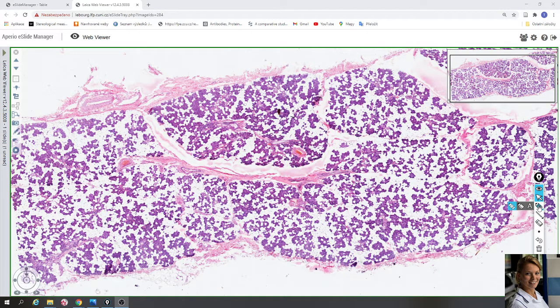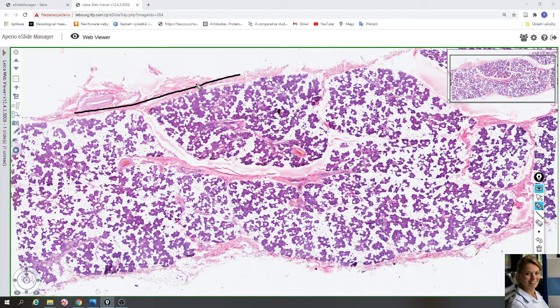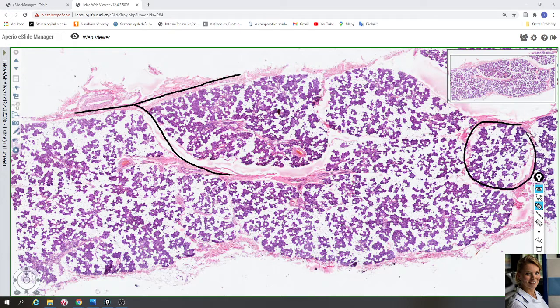The parotid gland is surrounded by a connective tissue capsule from which arise numerous septa that subdivide the gland into lobes and smaller lobules, for example here and here.